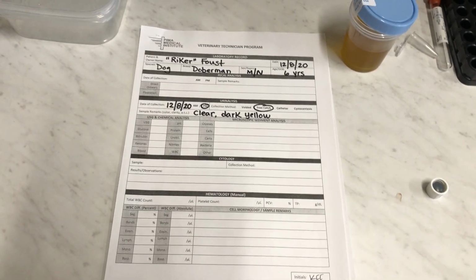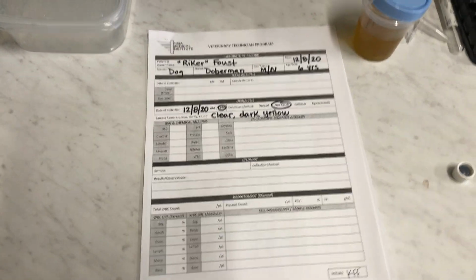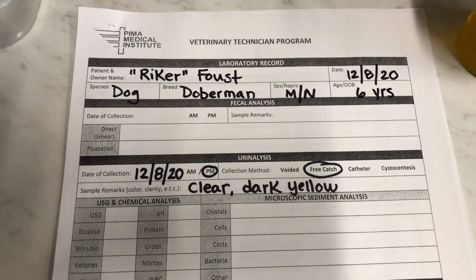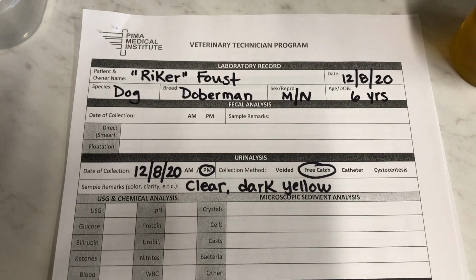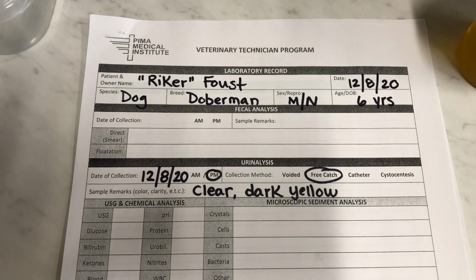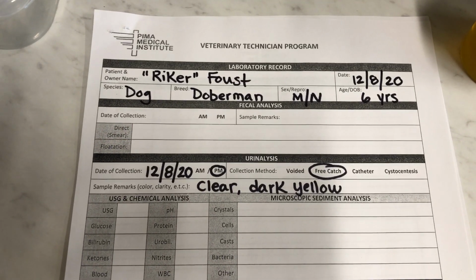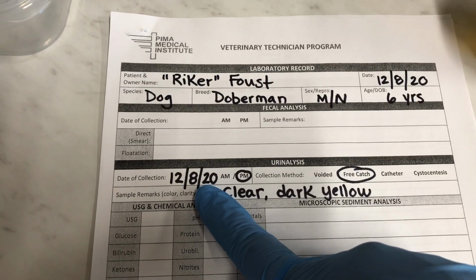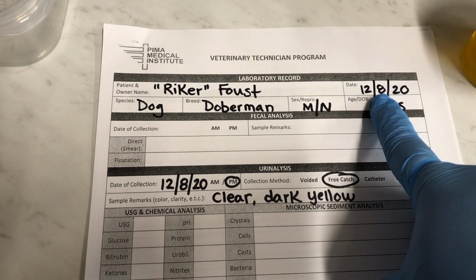Okay, I'm going to walk you through how to perform a basic urinalysis. So first you want to start by filling out your patient's information on your urinalysis record. We're going to be looking at Riker's urine today, and definitely want to make sure that you note the date that the urine was collected as well as the date that we're running the analysis.